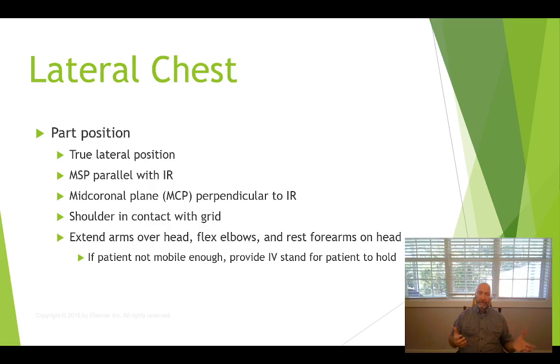and what you're going to do is you're going to tell the patient to turn and put their left side, turn 90 degrees, however you want to describe it, turn and face that wall, right? So you're going to point to the patient where you want them to be facing. I want you to turn your body and face towards that wall. I recommend that you tell the patient to put their feet together and point their feet at that wall. The reason for that is because once you get their arms up, sometimes the position of their arm on that wall bucky may turn them. So if their feet are pointing in one direction, you have a better chance of having the rest of the patient's body pointing in the same direction.